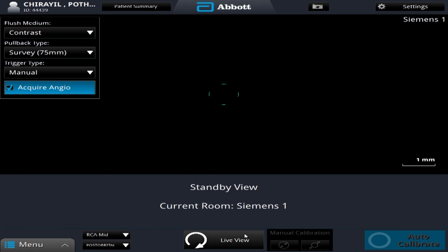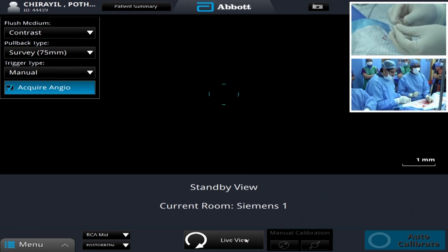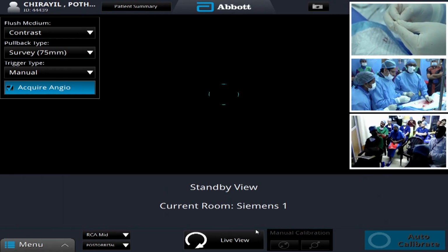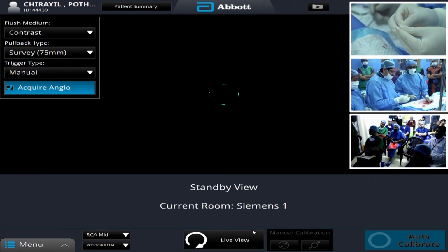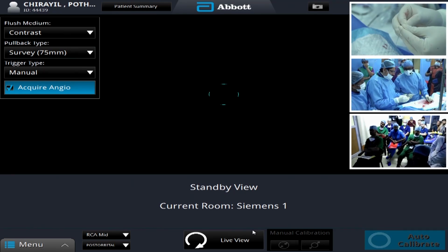We've stopped noradrenaline, right? Does this patient have bradycardia? No, he didn't have any brady at all, no hemodynamic changes. He's stable. When the vessel becomes bigger, the particles going down will be a smaller quantity, possibly. Then again, we probably wouldn't have done much with the orbital to the calcium, so not much particle going down the vessel. That also could be a reason.